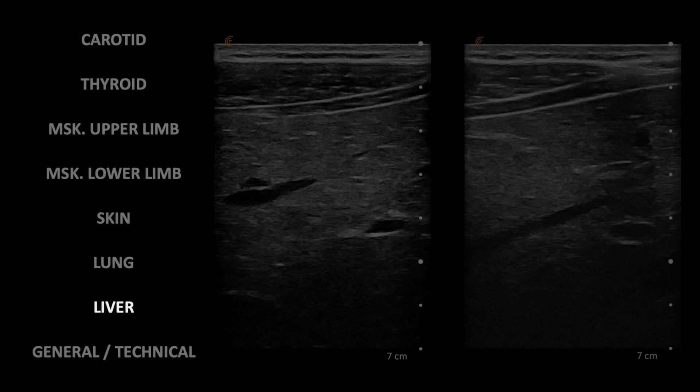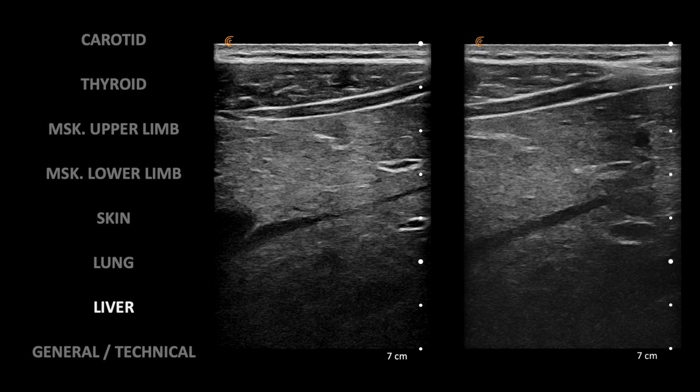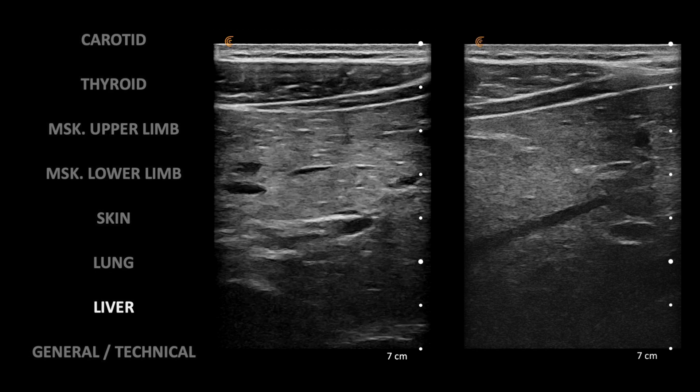This is not the optimal probe to scan the liver, but it is still able to obtain good images. I forgot to include the upper hepatic veins — apologies for that.